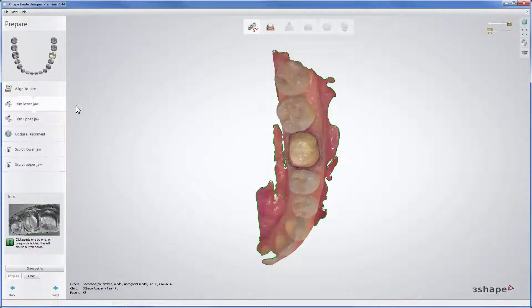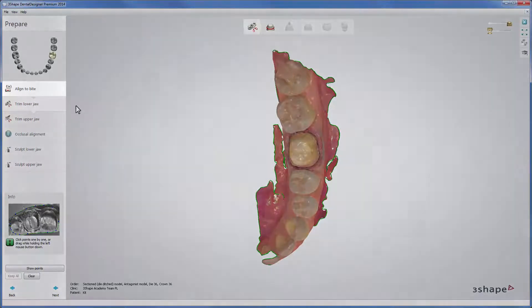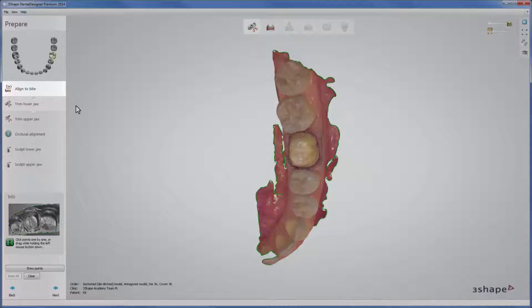When you go through the Prepare steps, Dental Designer skips automatically the Align to Bite step because it is usually done by the dentist. This step is required if the loaded scans have not been properly aligned.